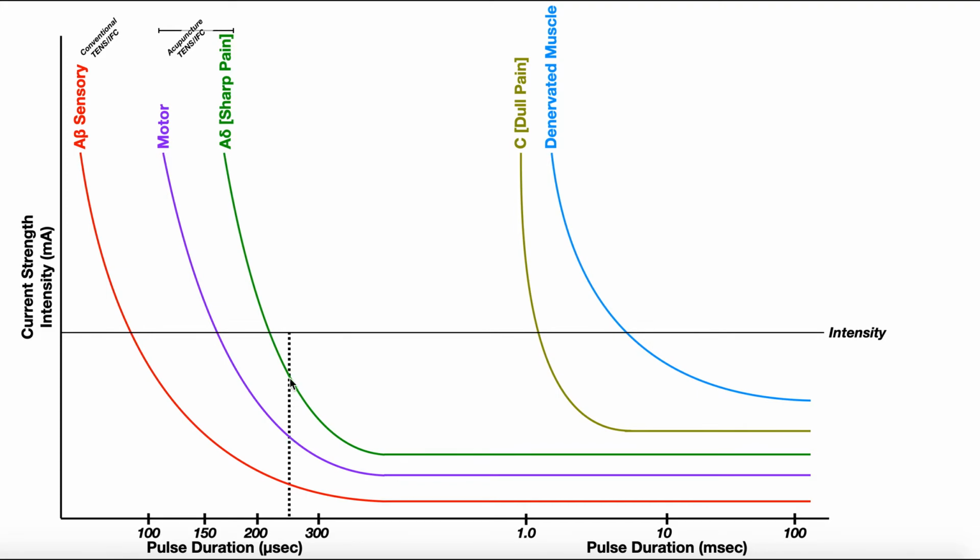Remember, the acupuncture setting is a lot more unpleasant than the conventional. Okay, the acupuncture setting you don't do as long, but it provides that analgesic effects afterward. Now, I mentioned that there are individual differences between people. Nobody's the same, right? So if you actually took the time, which nobody does, to construct these curves for two different people, they may look slightly different, right?